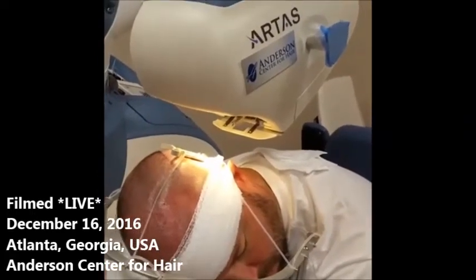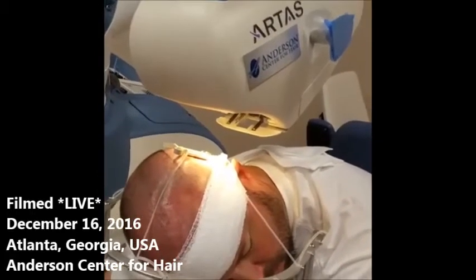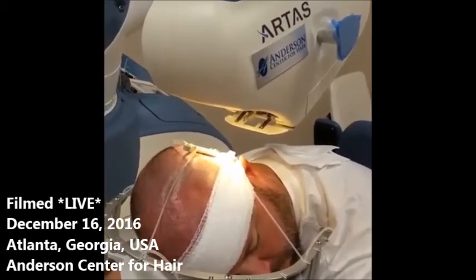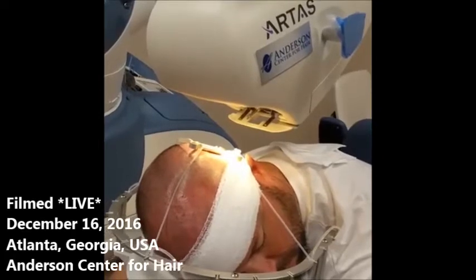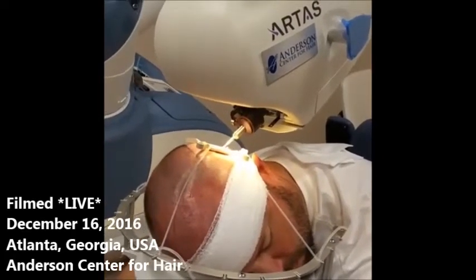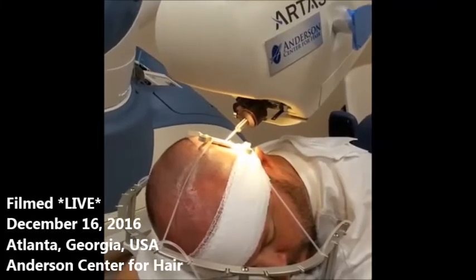I'm going to start with one, Jason, just to get you used to the sound and make sure you know it does not hurt. Here we go. Did that hurt? Not at all. Okay, we're going to do about nine more in a row here.